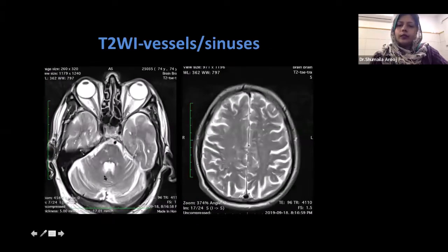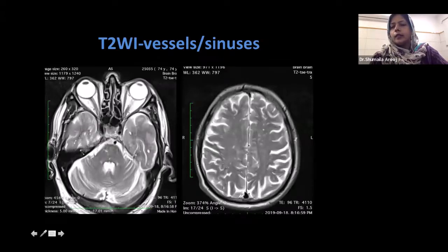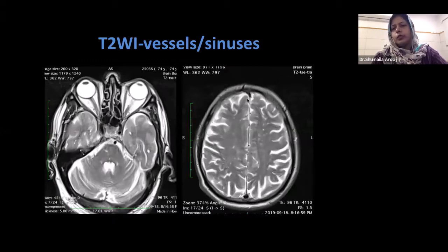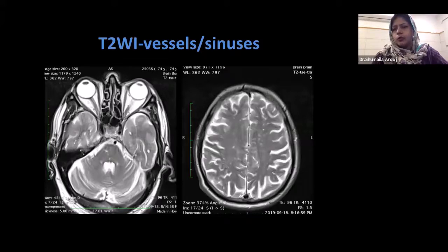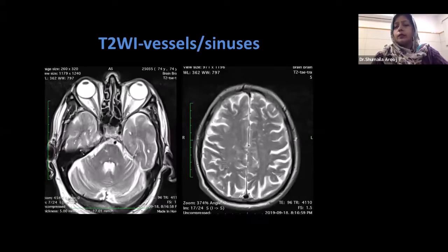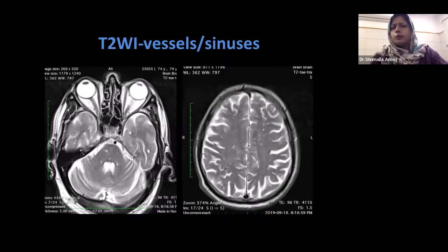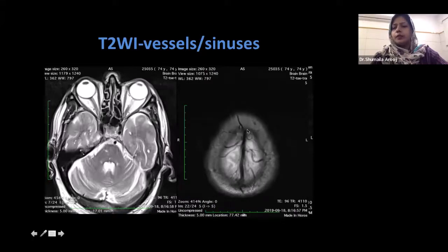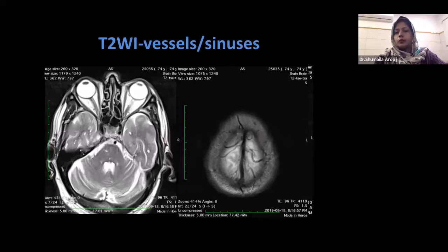It is very important to look at vessels on T2-weighted images. For example, this is the basilar artery, these are internal carotids bilaterally, this is the superior sagittal sinus posterior and anterior aspect. When you go to your venous sinus thrombosis and stroke sections, you will find that on T2 you are able to pick up a venous sinus thrombosis, superficial cortical venous thrombosis, or a thrombus in an ICA, basilar artery, or vertebral artery. If you start focusing on this in every patient, you do find pathologies. They all appear as flow voids on T2-weighted images.